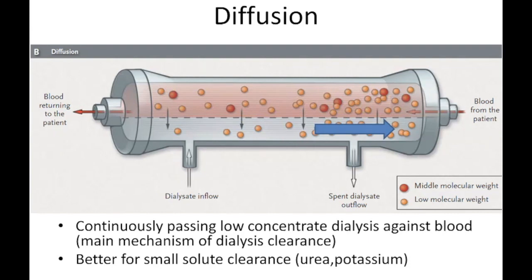And generally by using this continuous flow of new dialysate, we prevent the dialysate from ever becoming fully saturated. And so we can continue and cycle that process. And so a typical 3 to 4 hour dialysis session can clean, generally, the total body water of the patient reasonably well 3 times a week. Will prevent most of the side effects of end-stage renal disease.